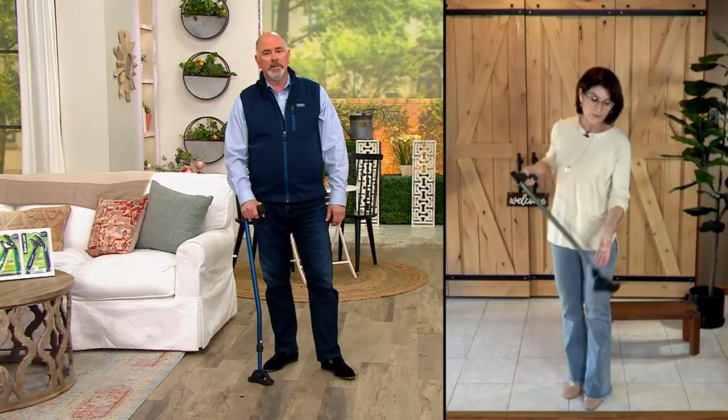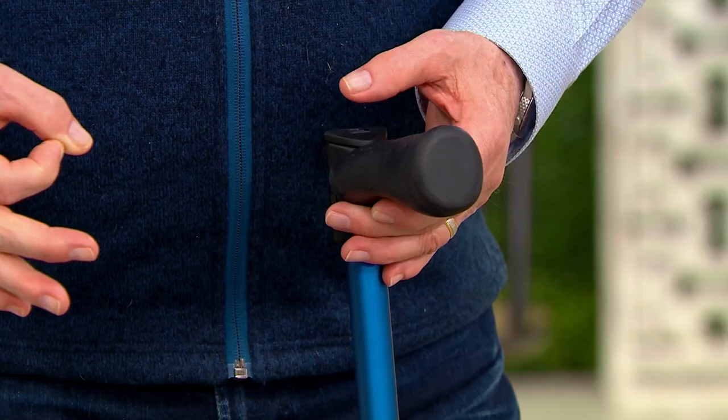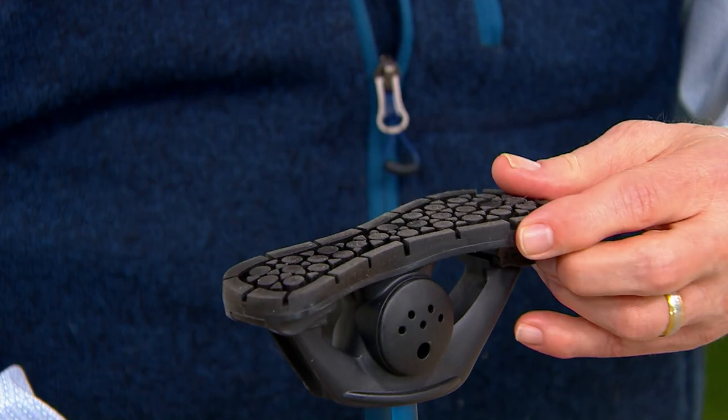I see ladies in a stiletto heel and wonder how they can walk. A regular cane is just a pin point of a wooden stick. Doesn't it make sense to have the foot of a cane be considerably larger? Literally, its footprint is going to make you more secure. The tread on the bottom is not a fashion design — it's done for a purpose. If you look closely on the edges, you see slits on both sides. That's there to push water or any moisture out from underneath it so you get a better grip.